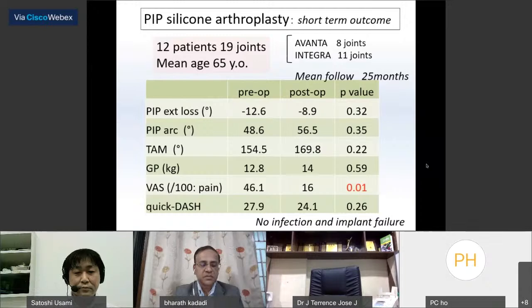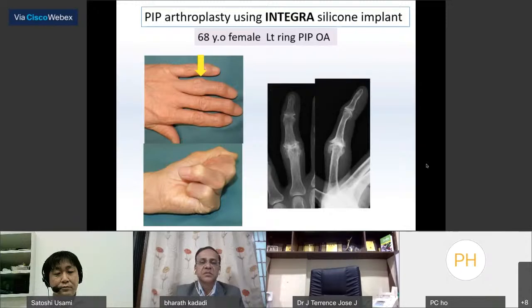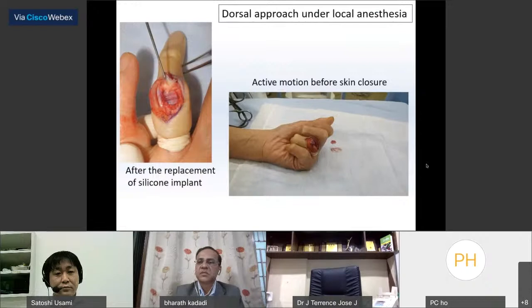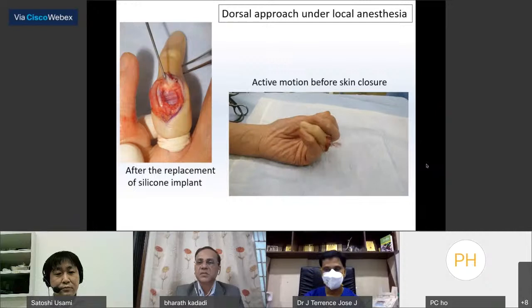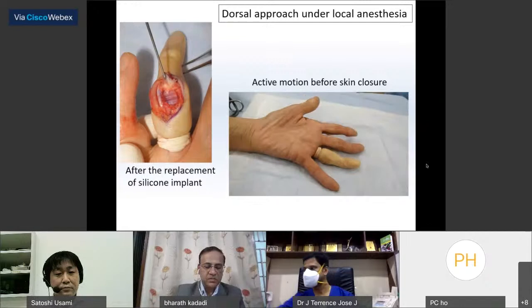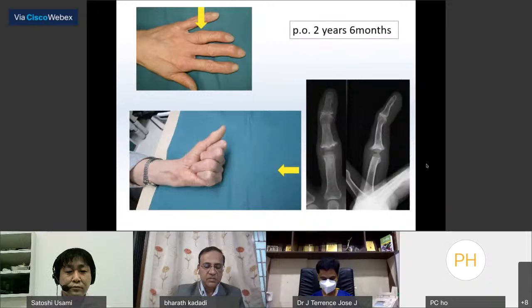Now I show a clinical case of PIP arthroplasty. This case is a 60-year-old woman with left ring PIP osteoarthritis with severe deformity. The PIP joint was replaced with an Integra silicone implant. The surgery was performed under local anesthesia with the wide awake approach. In this case, the extensor tendon was cut with a V-shaped incision. After insertion of the silicone implant, the extensor tendon was strongly sutured. This movie is an intraoperative active range of motion after extensor tendon repair. At 2 years, 6 months after surgery, excellent range of motion of the ring finger and proper axial alignment are achieved.